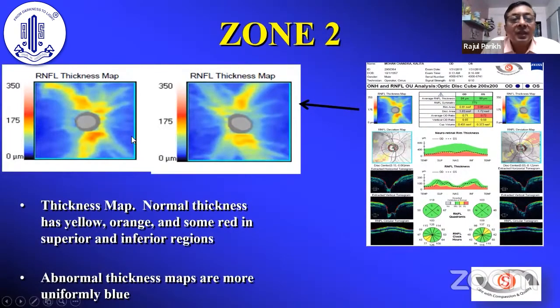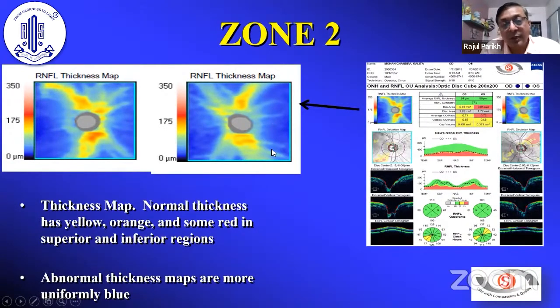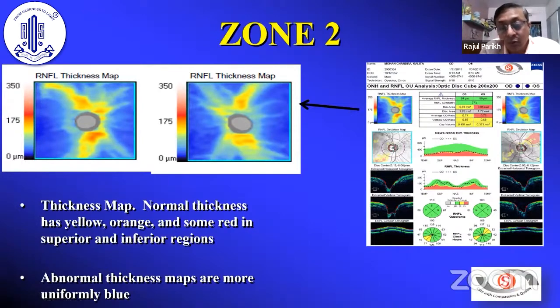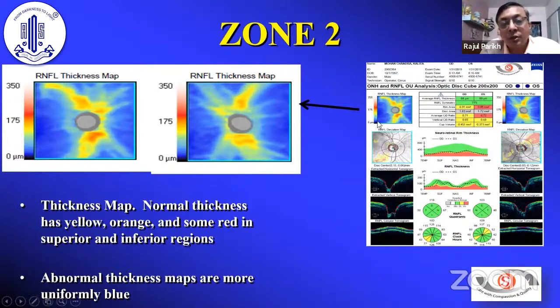Zone 2 is the thickness map obtained by the machine. Remember: the darker the color, the more normal the value. If there is red or dark yellow, the values are normal. If it is blue or light blue, the RNFL is thin. This gives the gross value.